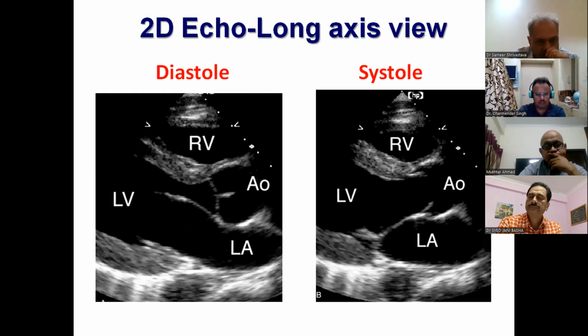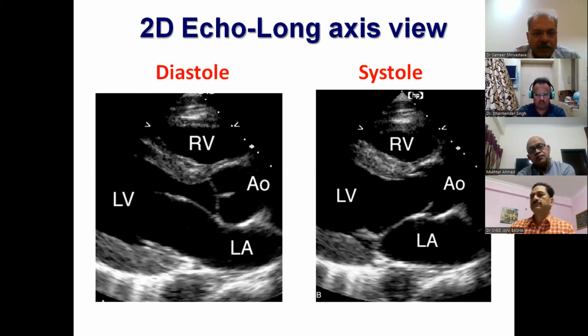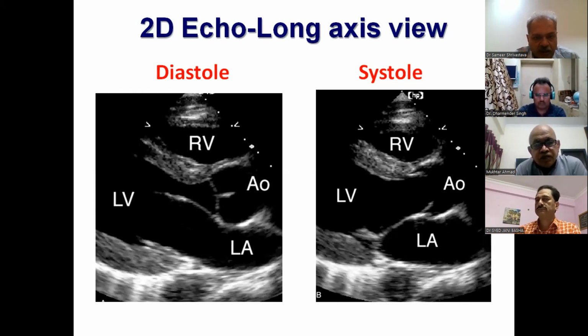So you take measurements in diastole for all the LV dimensions. In systole, you take dimensions for the annulus, you take dimensions for the sinuses, and there is a little bit of a ridge. The moment the sinus is finished, this ridge is called the ST junction, which is the sinotubular junction. It has assumed importance because this is the place from where the aorta actually arises embryologically, and this aorta should be traced in all patients of aortic stenosis because dilatation and effacement of the sinotubular junction is one of the predictors for aortic aneurysm or dilatation in aortic stenosis.